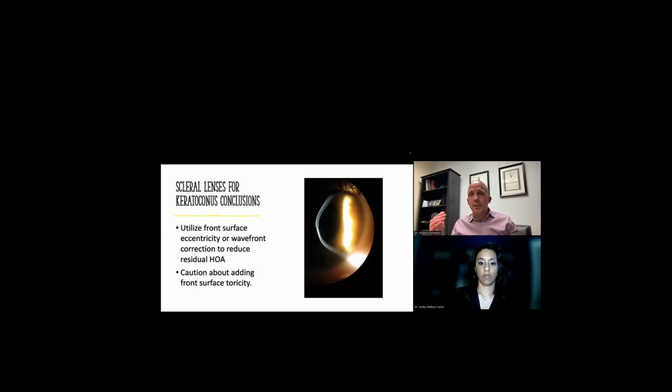If you have this patient that has a clear cornea, they're 20/30, 20/40, and everything else about their eye front to back is healthy, you can count pretty much on that it's residual aberrations, and you can just give it a try. And again, it's not a huge investment. You could just even try one lens just to see what would happen with them. And it could be worth your while.